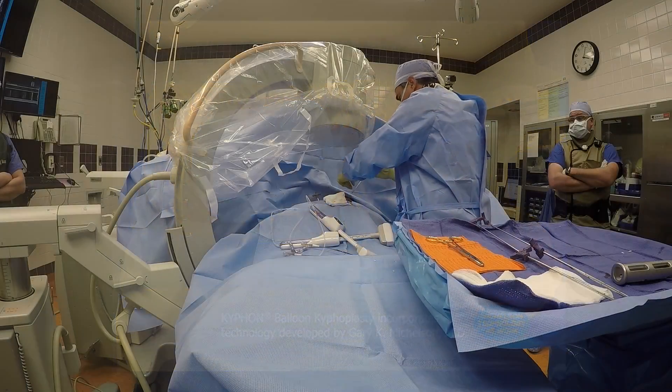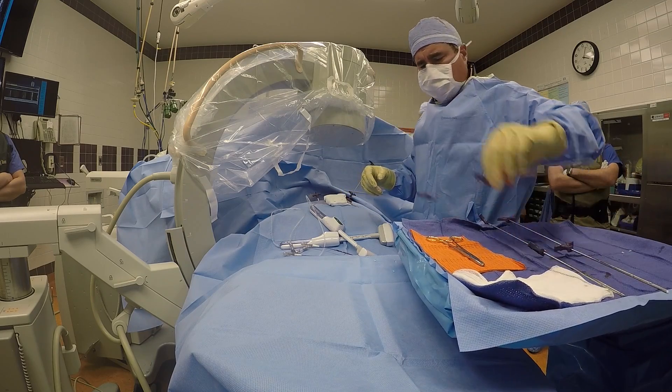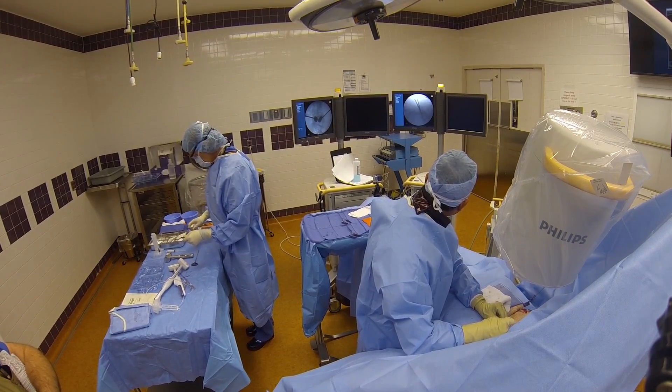it not only has an opportunity to restore the height of the collapsed vertebrae, but it also creates a cavity into which the polymer, or bone cement, can be injected in a controlled manner.